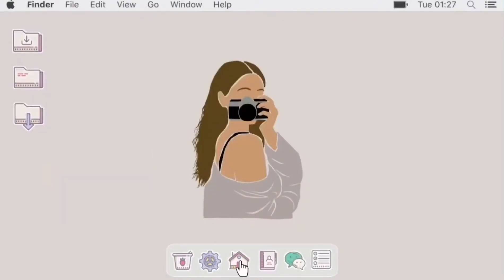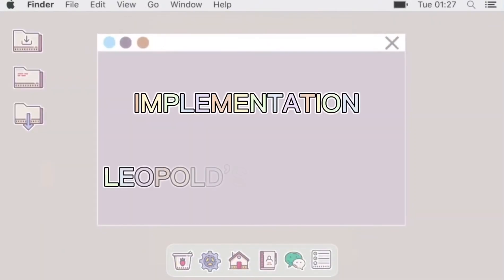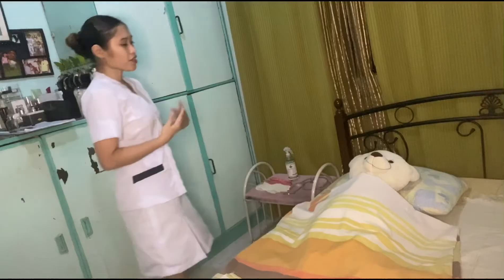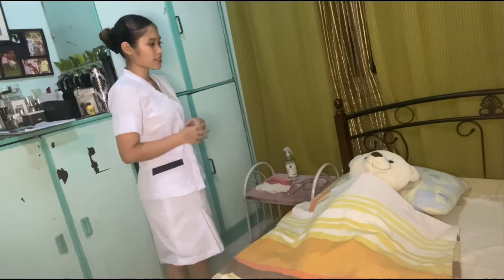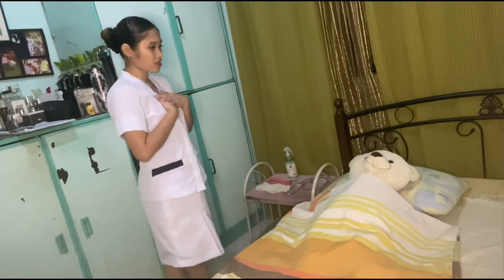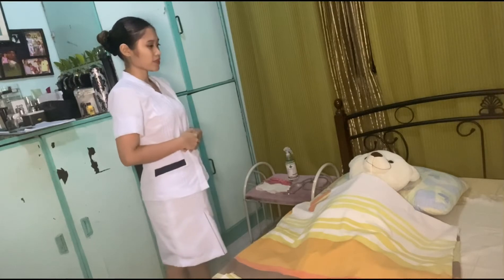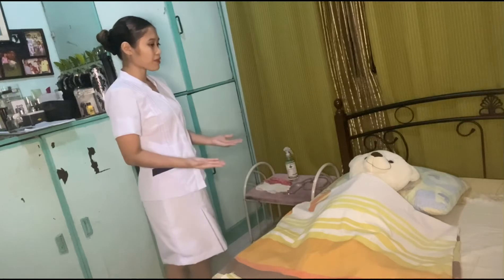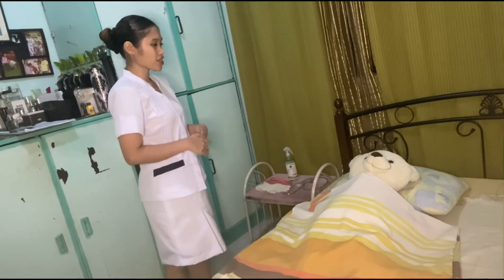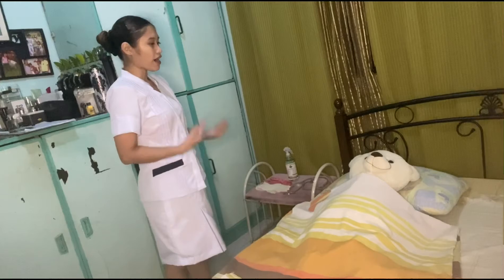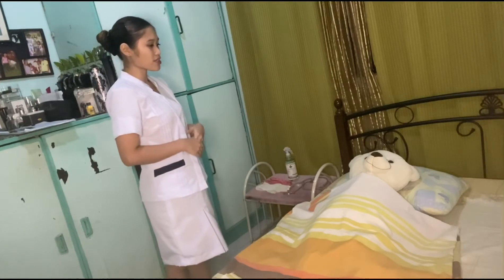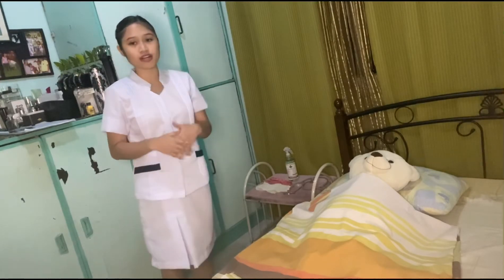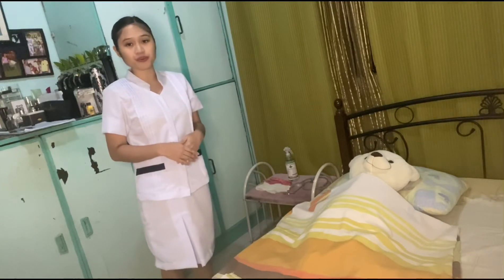Good morning, Mrs. Cruz. I'm Jillian Denise Gregorio and I will be your student nurse for today. May I know your full name? So for today, we will be doing Leopold's Maneuver — we will be able to identify the positioning and presentation of your baby. After assessing Mrs. Cruz's AOG, she is currently on her 28 weeks, which is appropriate for Leopold's Maneuver.